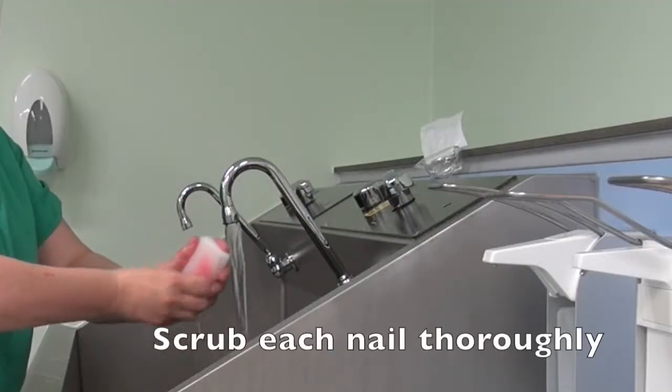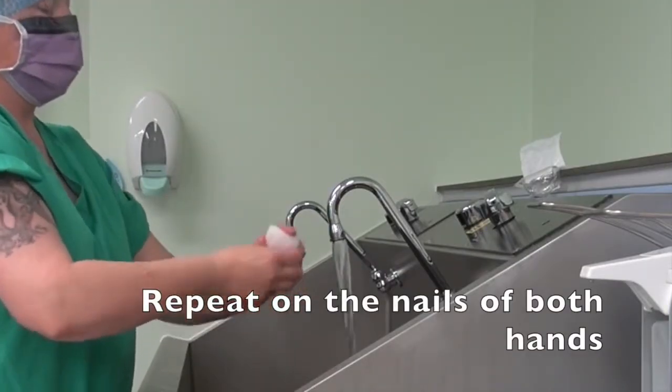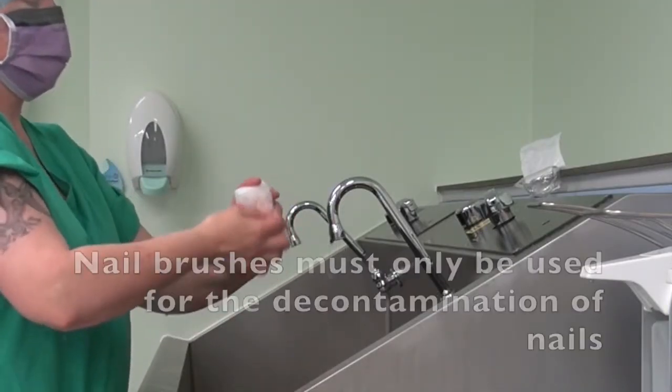Scrub each nail thoroughly and repeat on the nails of both hands. Nail brushes must only be used for decontamination of nails.